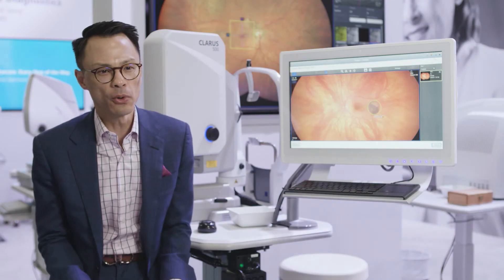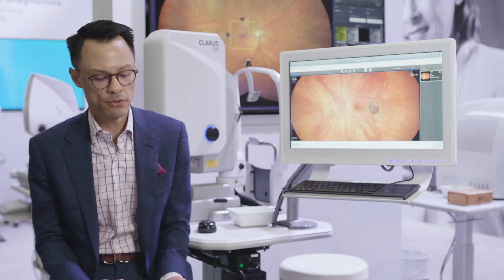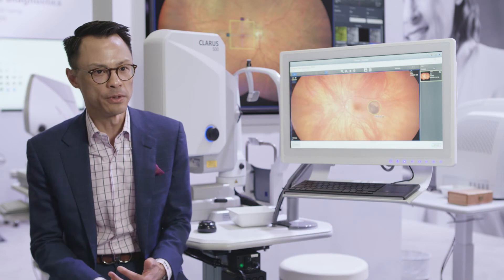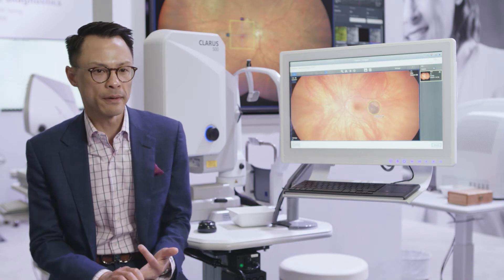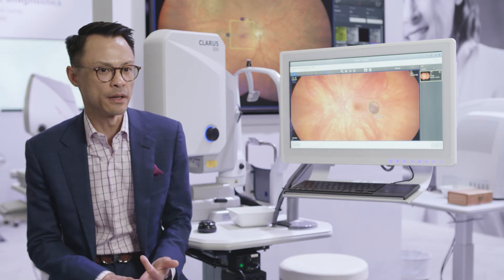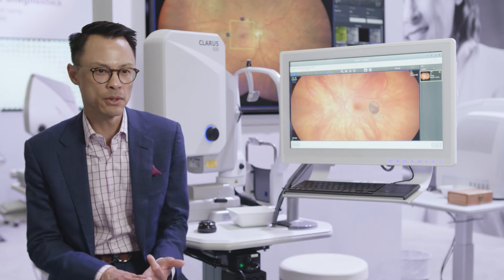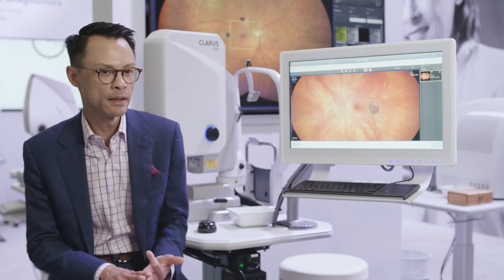If you want the full representation of the eye from clarity, color, and field of view, there's no other ultra-wide field out there that can capture all three of those key components that are so important for taking care of the eye than the CLARUS 500.